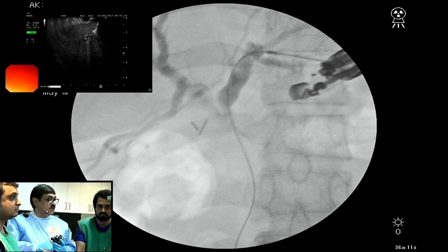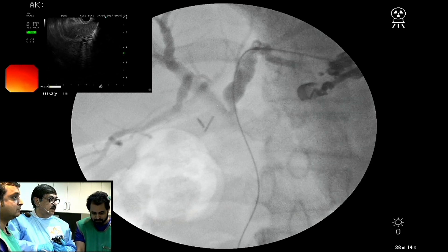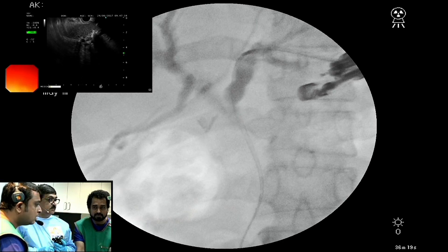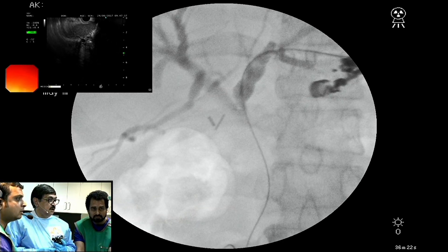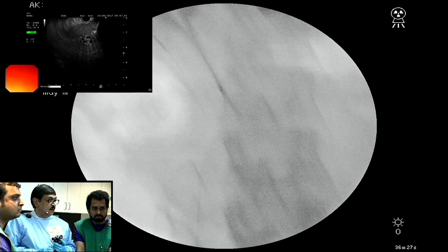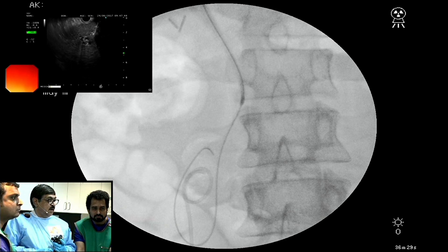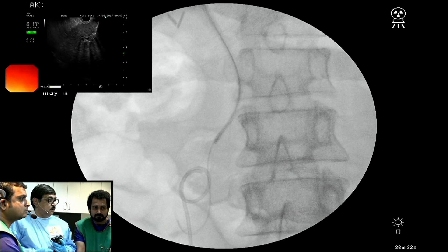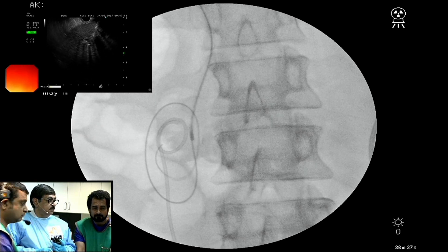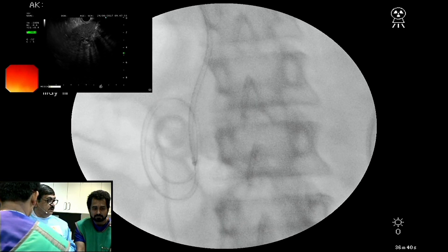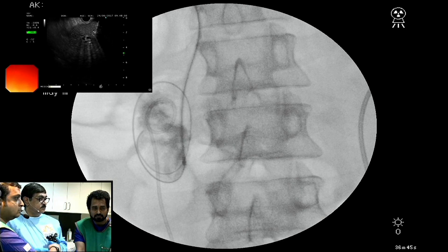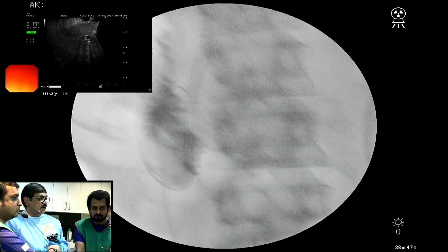I am using a 6-French cystotome to get into the biliary system. I think I am in now — careful. We are in the bile duct now and will try to go to the duodenum. We draw the wire and inject to confirm. Are you using contrast to make sure you are in? Yes. So we are in the duodenum.